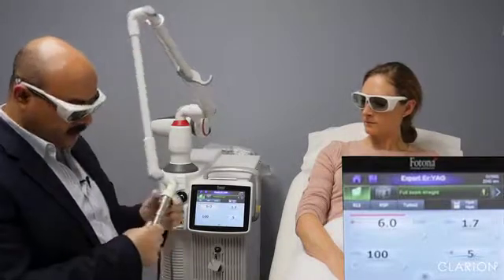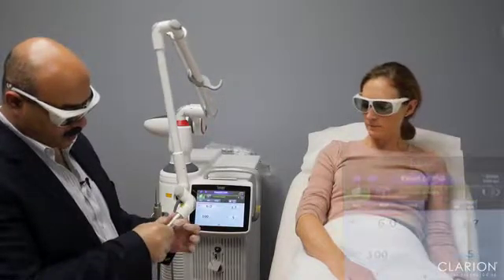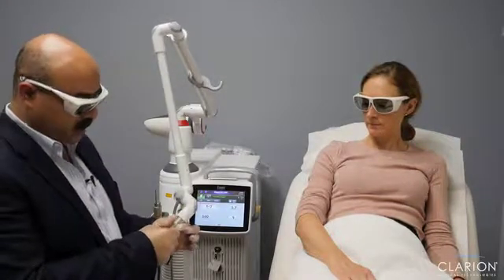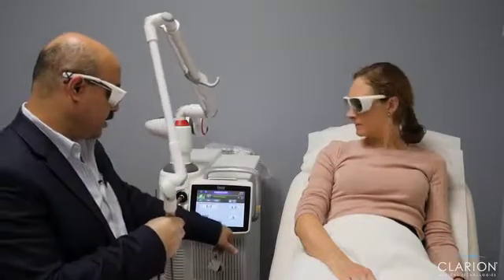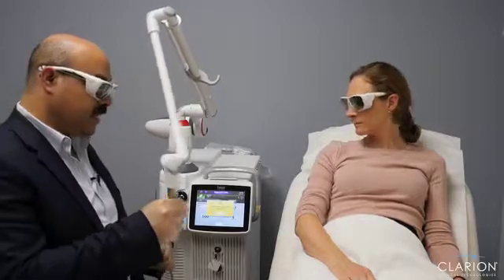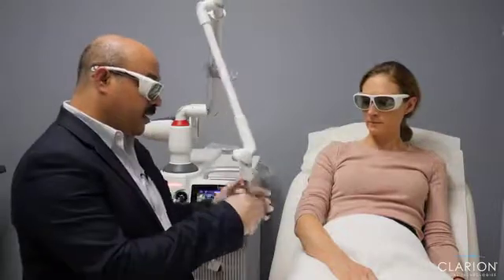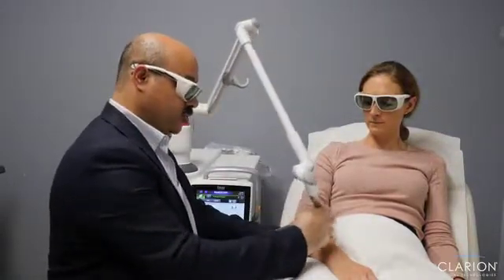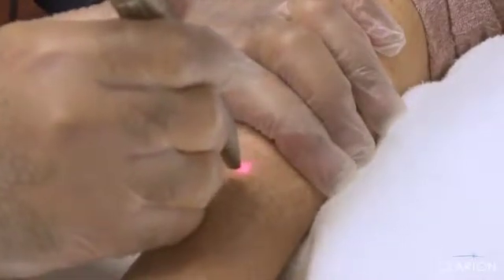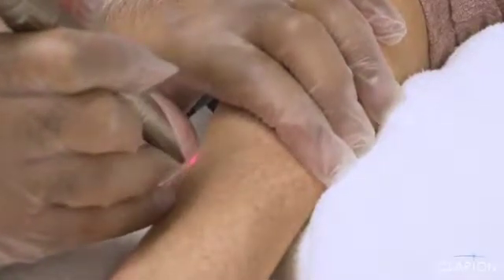So we are adjusting the spot size to 5. So this is a 5 millimeter spot, and we put the machine on ready. We confirm that this is the 5 millimeter spot, and we start to treat an area with the objective of resurfacing to improve the color of the area. Courtney, this is going to be just the same. With this, we are supposed to be using a smoke evacuator.